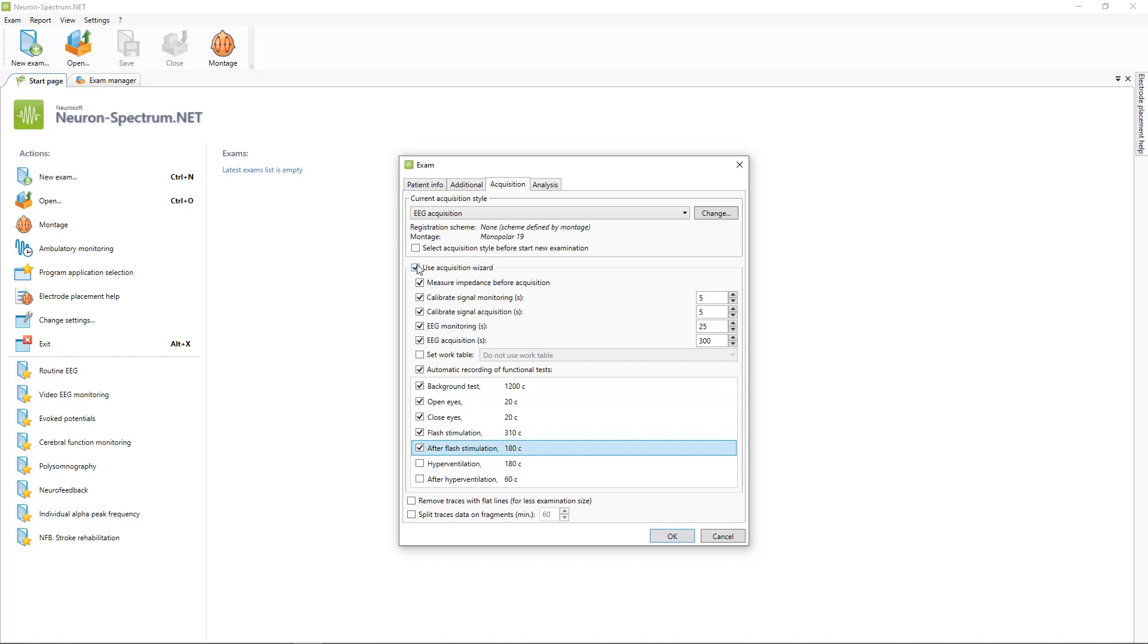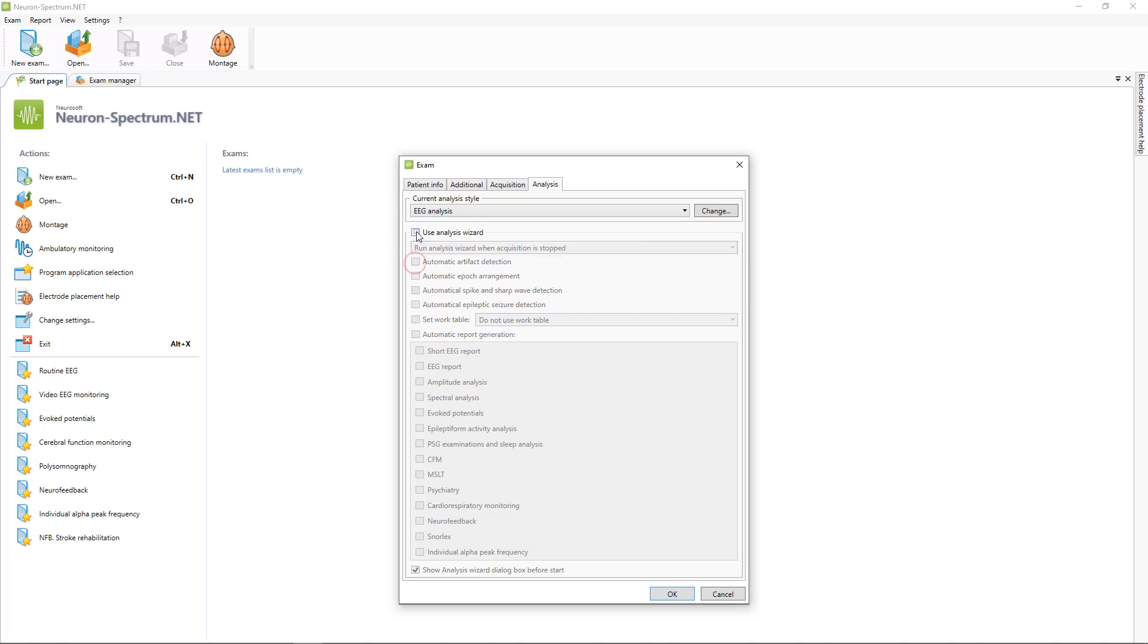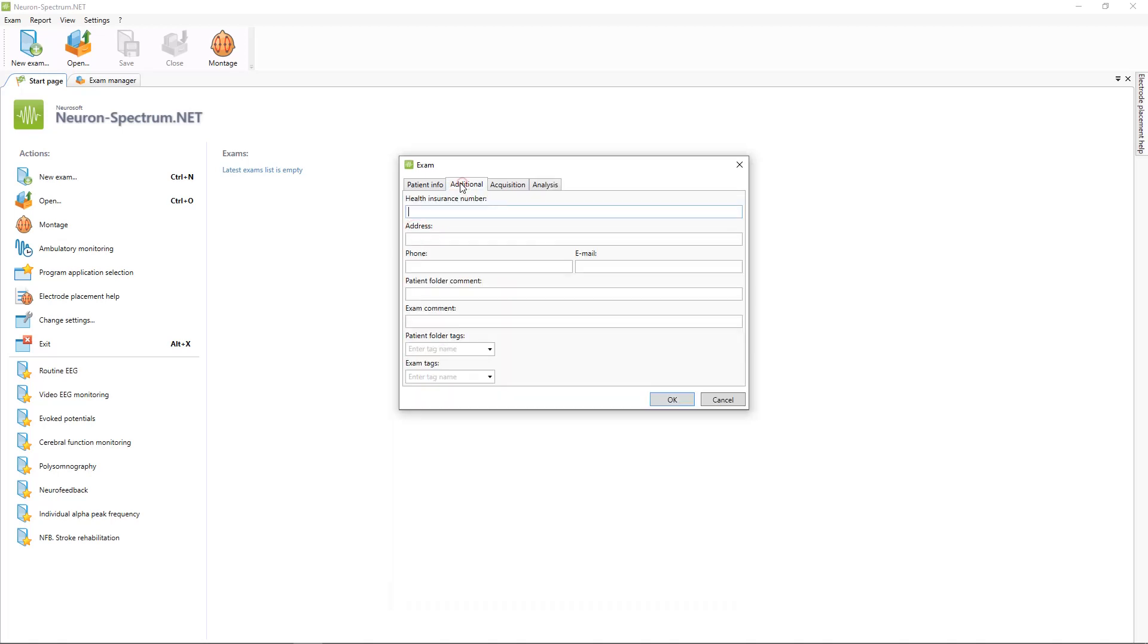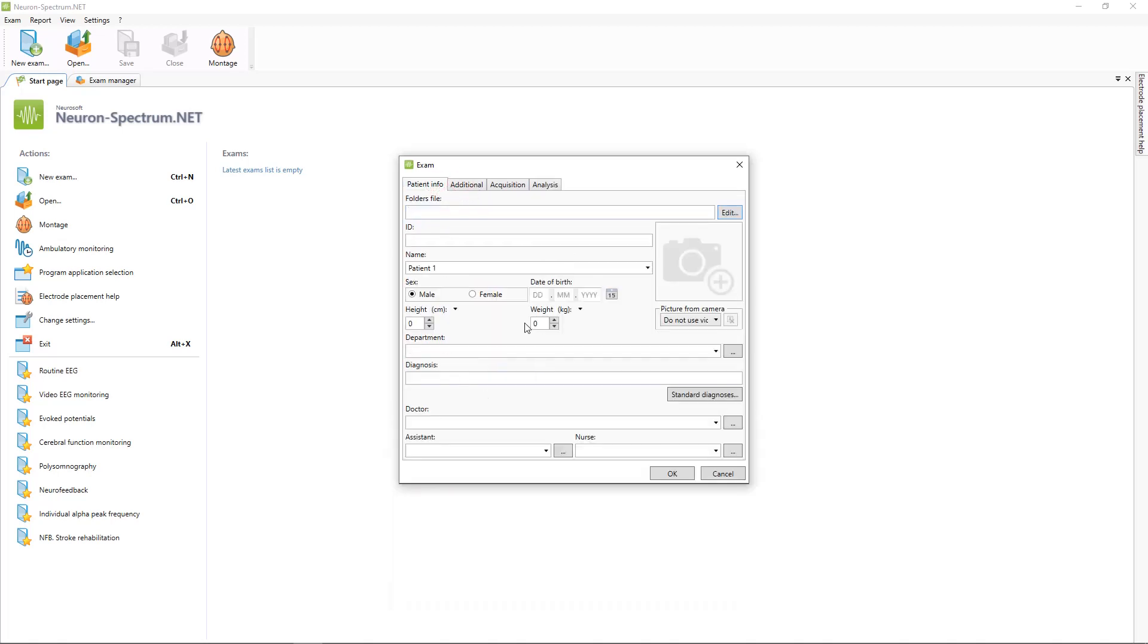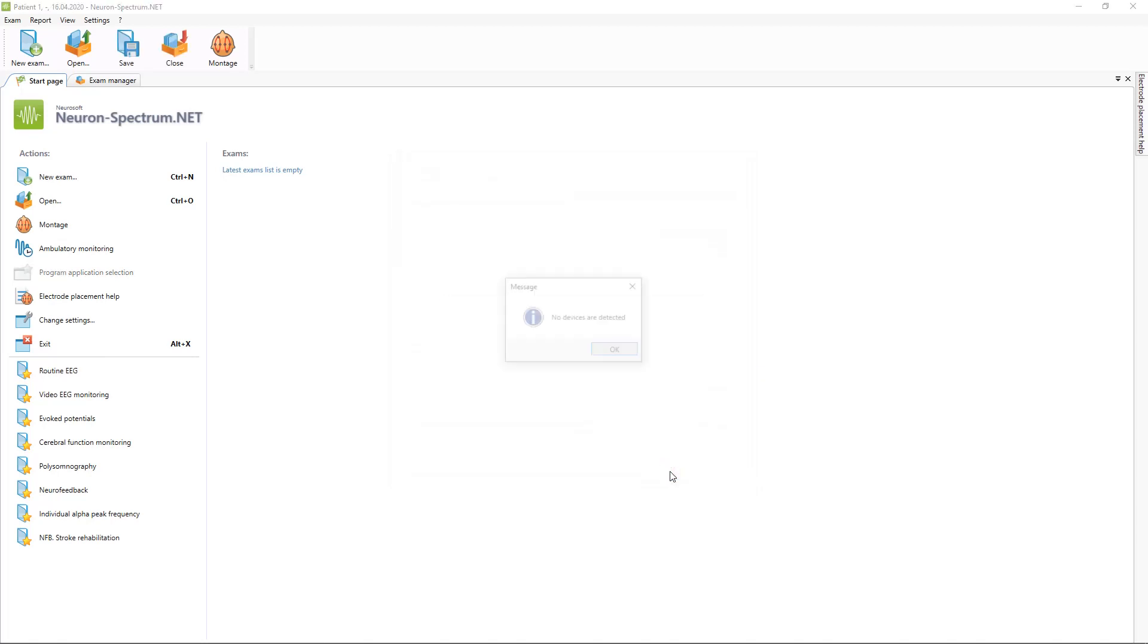But in this example, I will not use acquisition wizard. And also you can set up analysis settings. Also you can use analysis wizard and you can select what actually need to do after acquisition is finished. When you put all information about your patient, you need to press OK button and now examination is created.